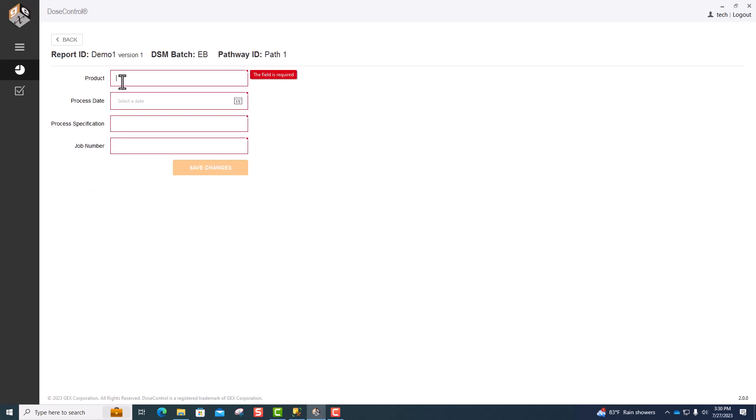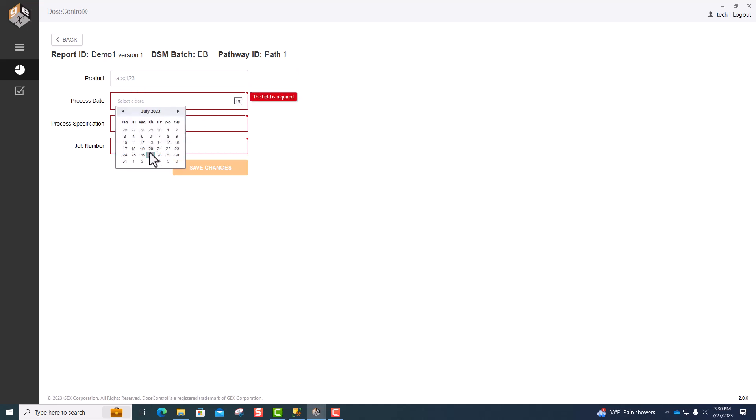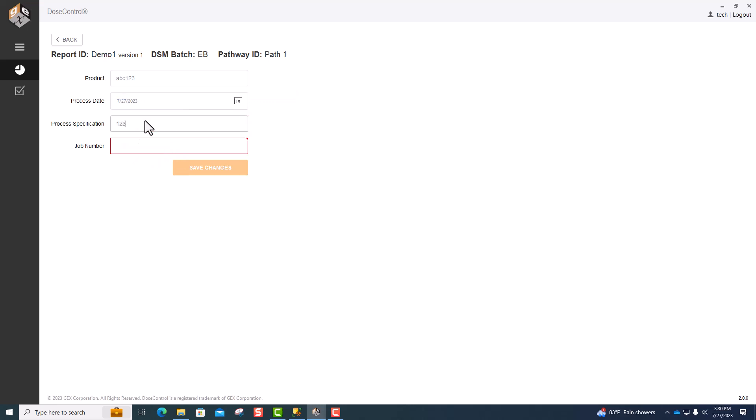In this window, you have options to fill in your report header fields. These fields are fully customizable. Hit Save Changes when you're ready to go.